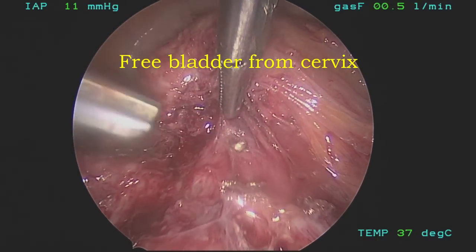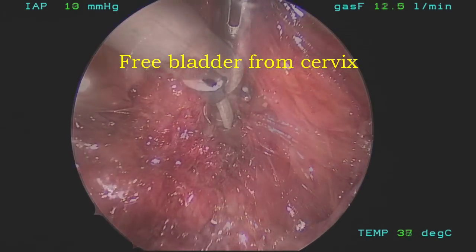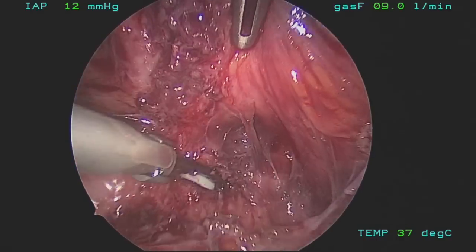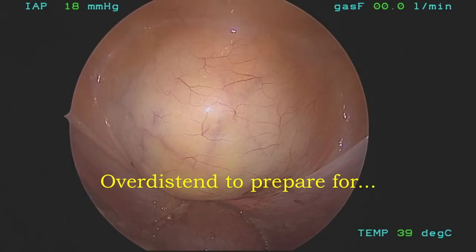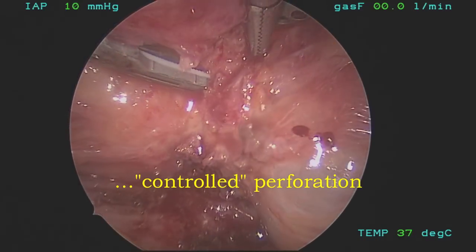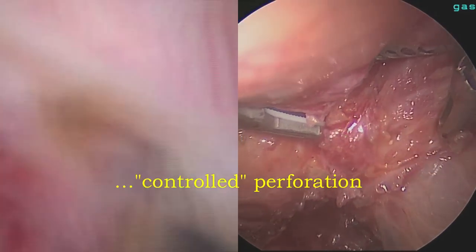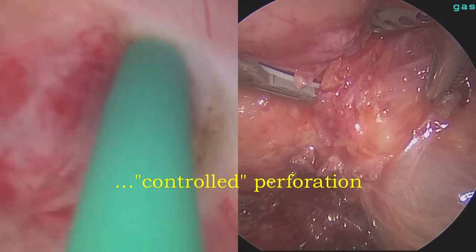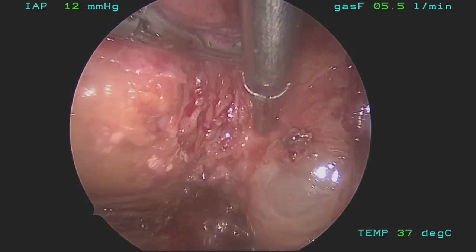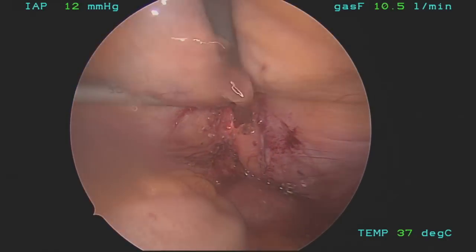Next, the surgeon wants to free the bladder from its attachments to the cervix. You must have good margins to reapproximate the bladder wall. Once these adhesions and attachments are freed, the bladder is over-distended to allow for a controlled perforation. The urologist then inserts the electrode into the most superior aspect of the lesion and then perforates the bladder. The laparoscopic surgeon can now enter superiorly, therefore marking the most upper portion of the lesion.